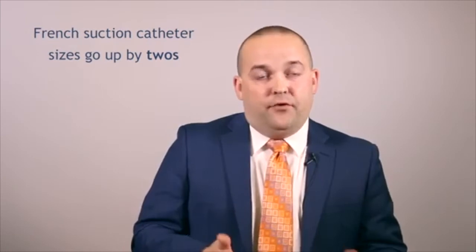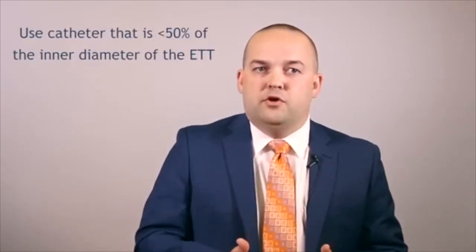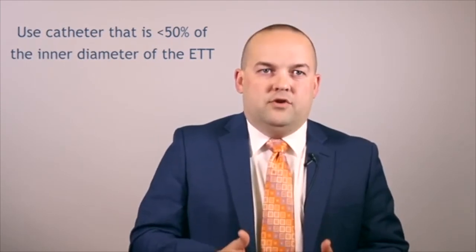And just a note, suction catheter sizes in French go up by 2, so you would use 14 French, 12 French, 10 French, and so on as you go down the line. But for an adult, we should always remember to use a catheter that is less than 50% of the inner diameter of the endotracheal tube.